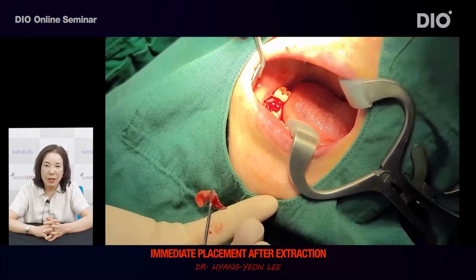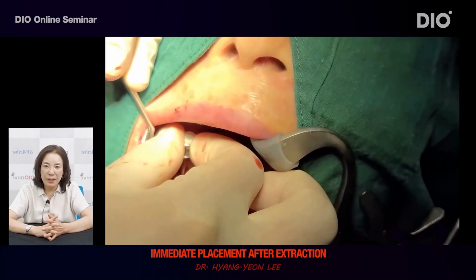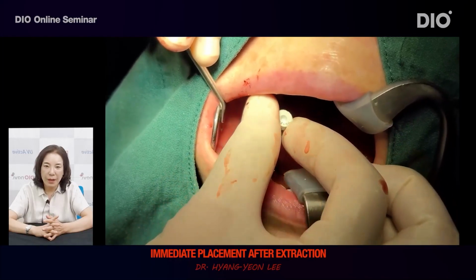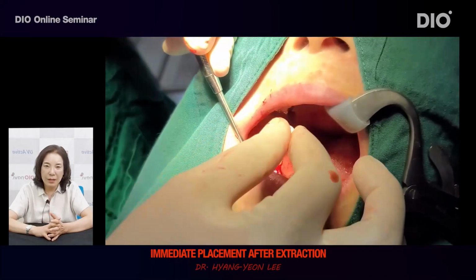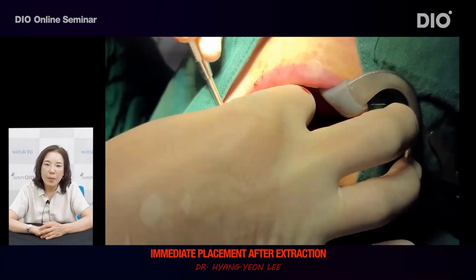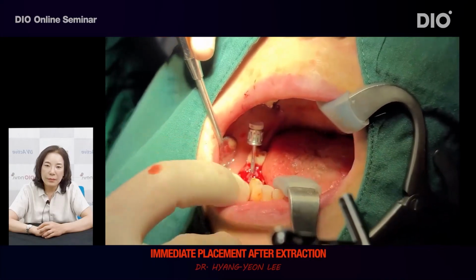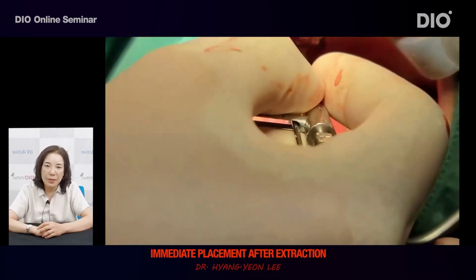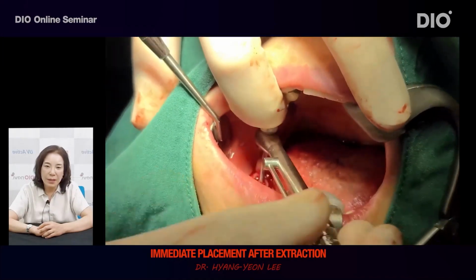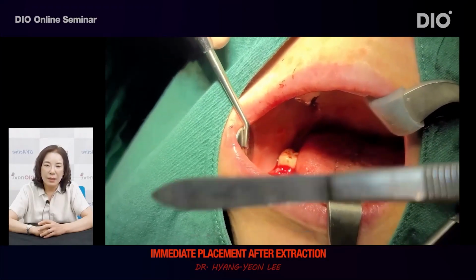Check whether the inside of the implant is visible through accurate suction and then mount inside the implant. Since the drill is too long, I change to a shorter one. Mounting is being done well. Check whether the initial fixation is achieved properly. There is sufficient initial fixation.